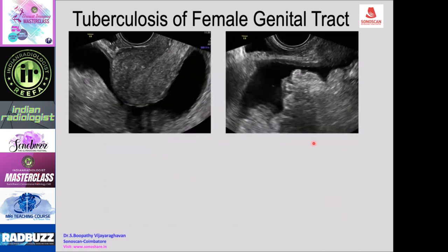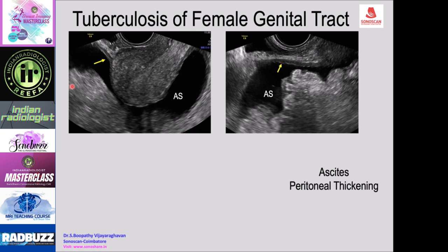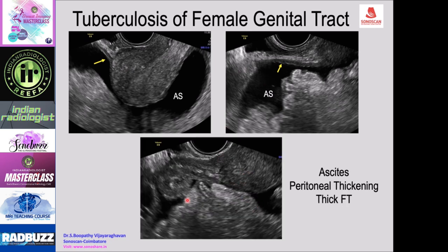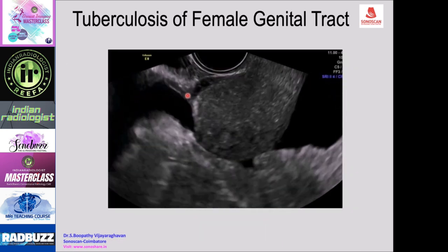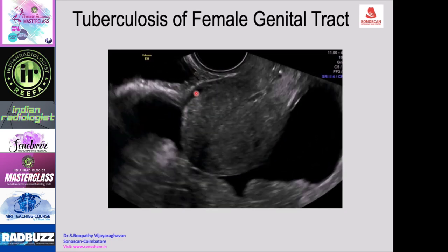In another case, the sagittal scan of the uterus shows obliteration of peritoneal recesses due to peritoneal thickening. The vesicouterine recess is obliterated with peritoneal thickening, ascites, and a thick fallopian tube visible in the pelvis. A dynamic scan video demonstrates obliteration of the vesicouterine recess, with no sliding of the bladder wall due to adhesions.